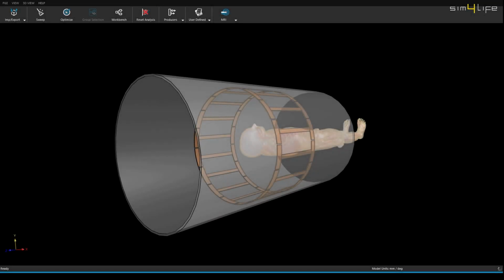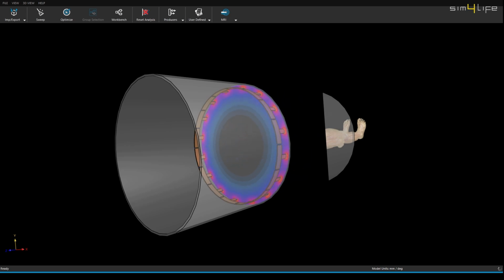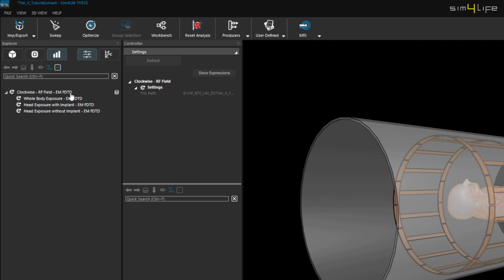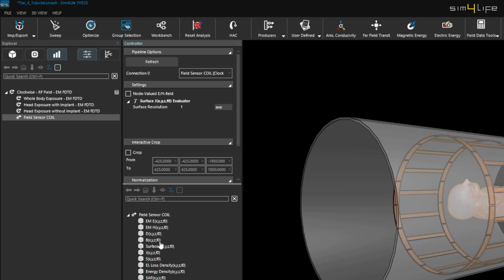At this point, it's time to gather the results and perform a safety assessment analysis. First, we will study the B field distribution to evaluate the success of achieving circular polarization by setting the two sources with a 90 degrees time shift. To do this, select the clockwise RF field simulation. Navigate to field sensor coil, then sensor extractor, and finally, B field.